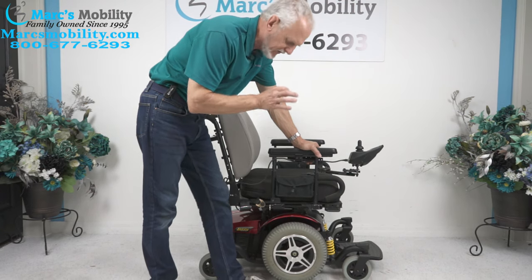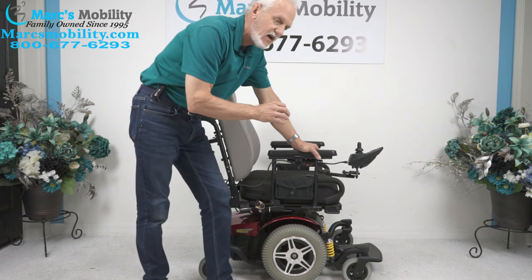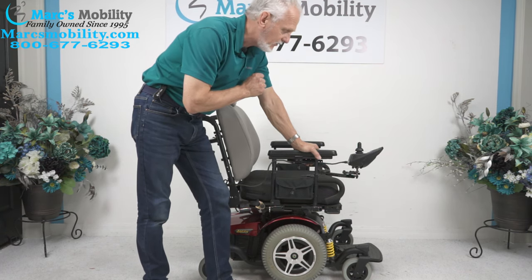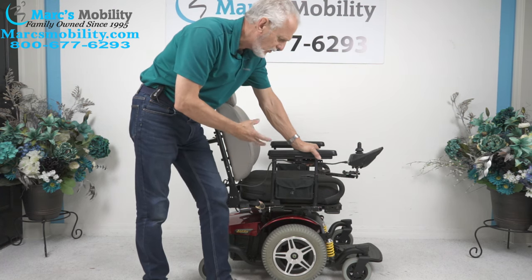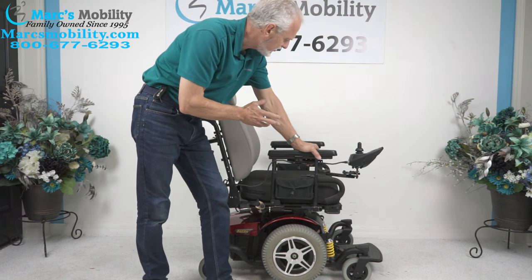We have here the Jazzy 614 HD — the HD stands for heavy duty. This has a 450-pound weight capability. It was used for less than six months, so it's still practically new. The reason I have it here is because it has a really nice seat that you don't see this type of too often on a 614 HD.